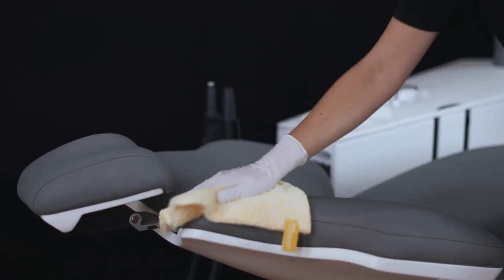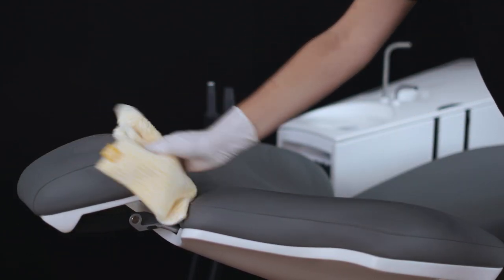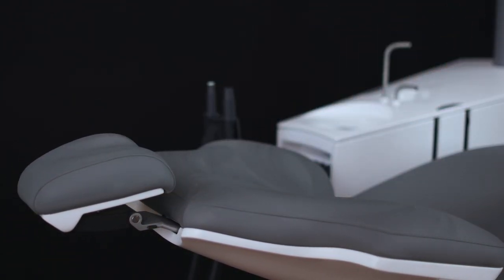To disinfect the upholstery after each patient and at the end of the day, use XO Gentle Disinfection undiluted on a cloth and wash the surface.